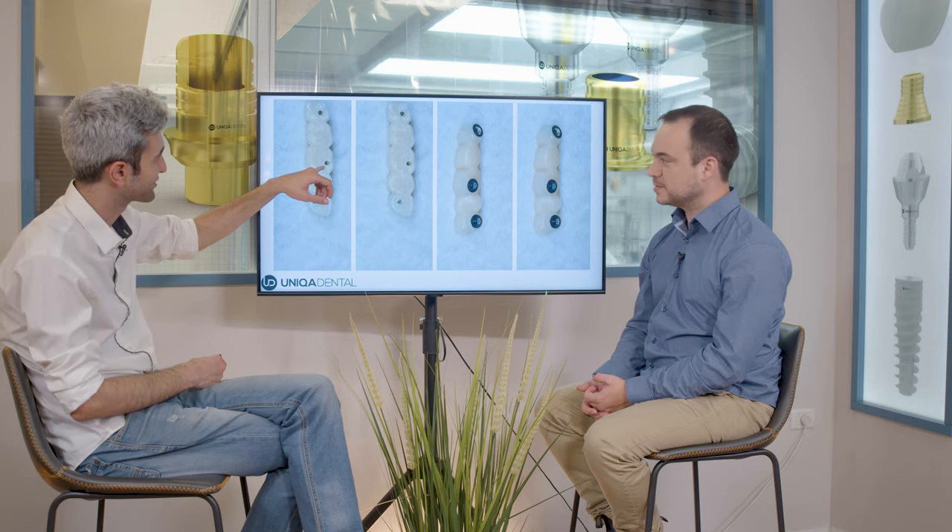This is the new bridge that was done. You can see the small screw channels — you can see how small they are. Here you have a five-unit bridge on three implants with very small screw channels, so the bridge is very strong.